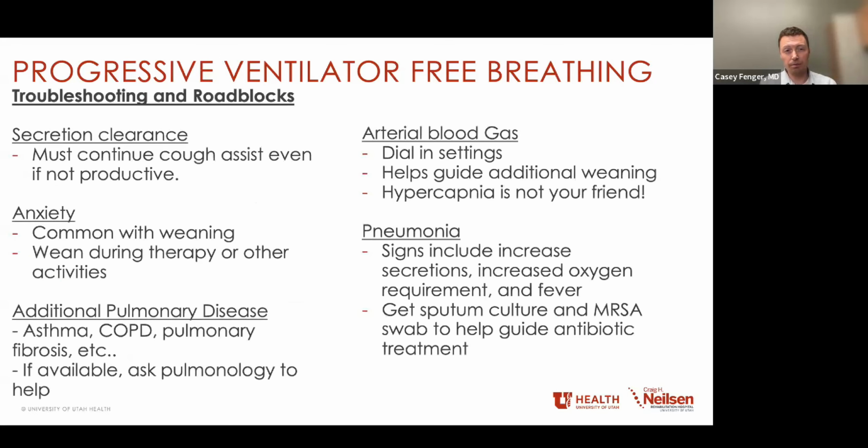So some troubleshooting and roadblocks that we run into with this progressive ventilator-free breathing and trying to get someone off of the ventilator. One, again, is secretion clearance. This is such a big part of this. And if you're not able to clear these secretions, again, you can't get someone off the ventilator. They're going to have continued pneumonia as well as mucus plugging.